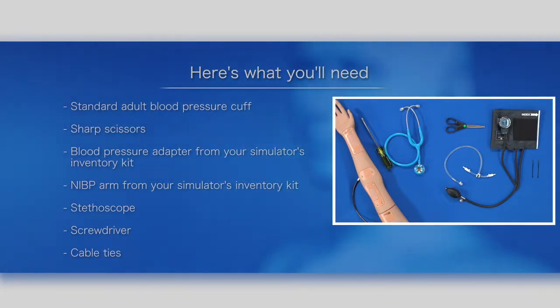Here's what you'll need: a standard adult blood pressure cuff, a pair of sharp scissors, the blood pressure adapter from your simulator's inventory kit, an IBP arm from your simulator's inventory kit if not already attached, a stethoscope, screwdriver, and cable ties.